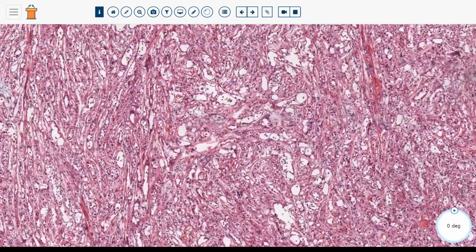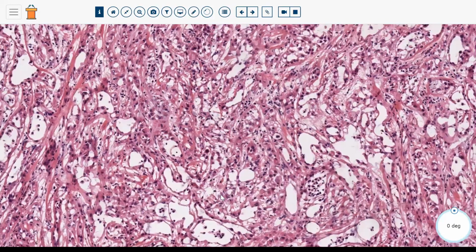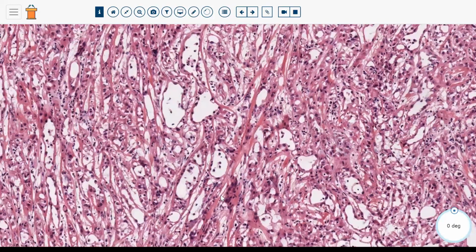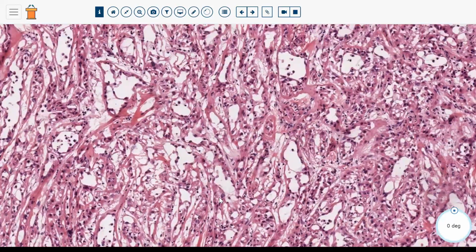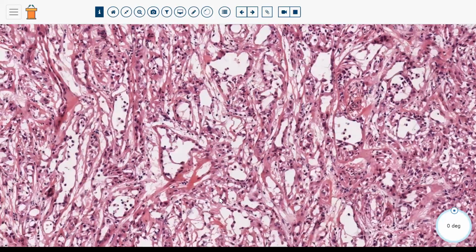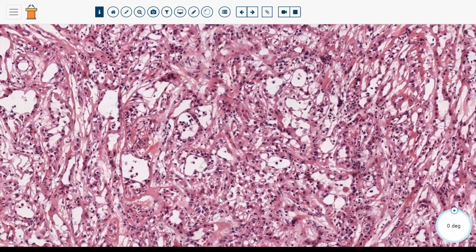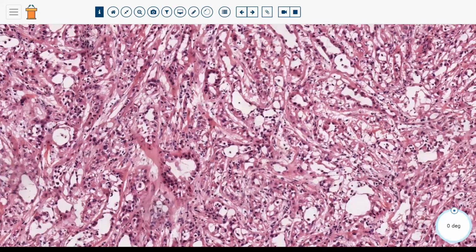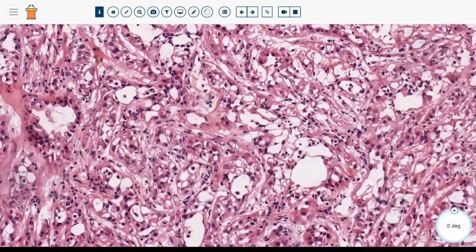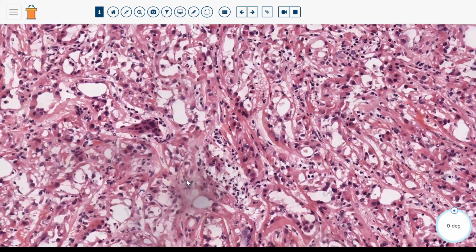The important thing to remember about these is that this is a mesothelial proliferation. And so if you use your common mesothelial immunohistochemical markers, that can help you to confirm the diagnosis. So they will be positive for cytokeratin immunohistochemistry. But if you use mesothelial markers like, say, WT1 or calretinin and so forth, that will be frequently positive, high molecular weight cytokeratin and others. That can help you to confirm the mesothelial origin of this proliferation if the case is morphologically difficult.